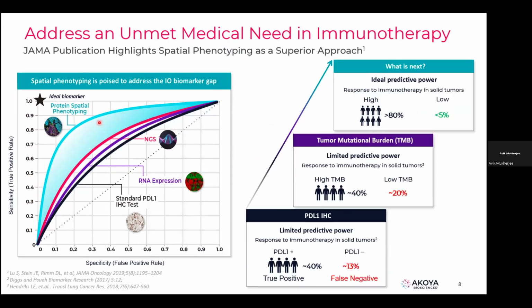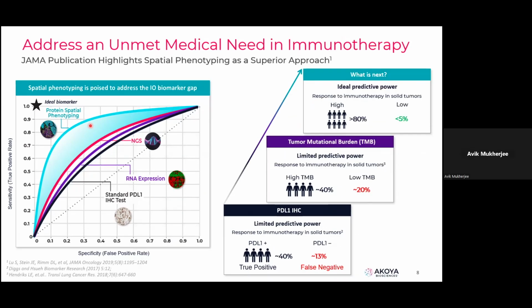And a very fun thing to mention here is that when this meta-analysis was done, they looked into papers with only 3 protein markers. That means with even 3 protein markers, you can get a better understanding of immune checkpoint therapy or even stratify patients into the right therapy group than other single marker RNA expression or NGS technologies.